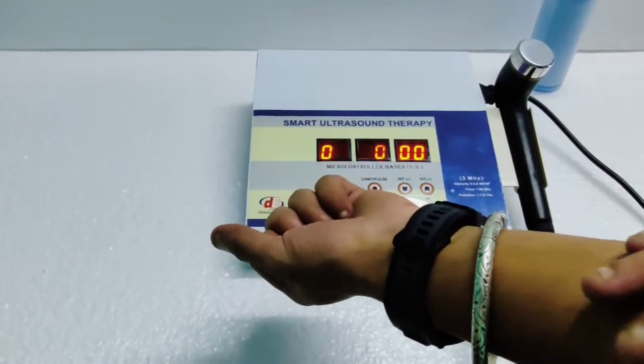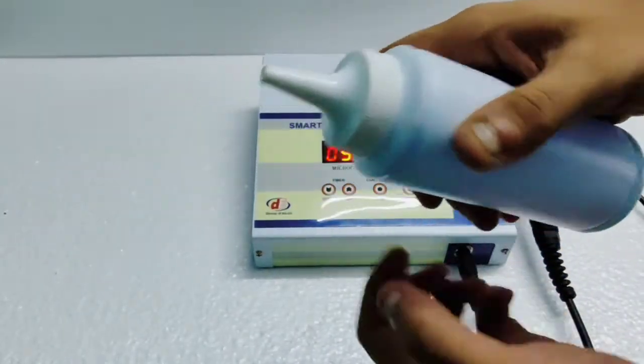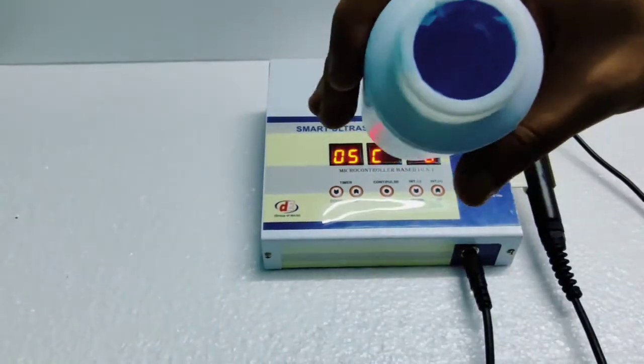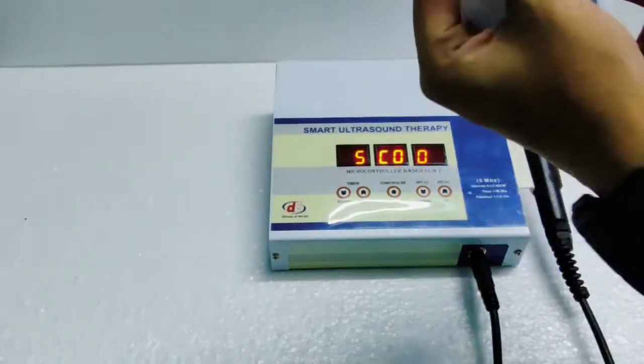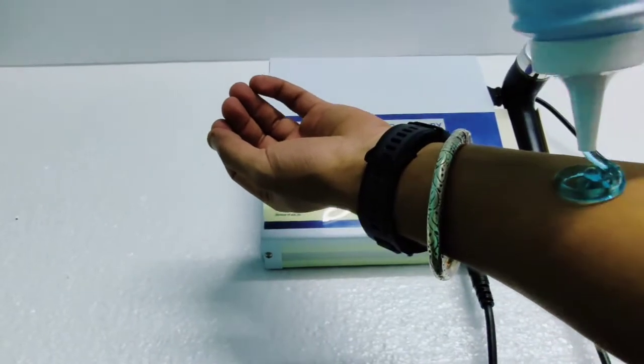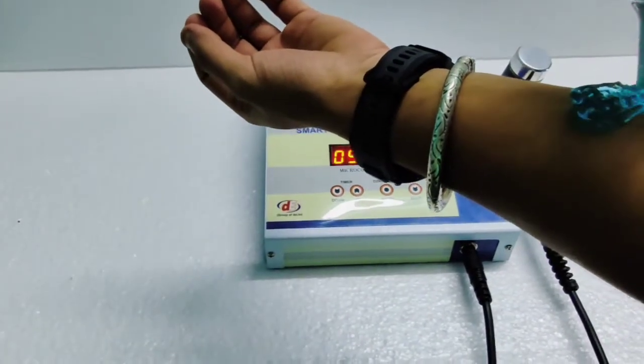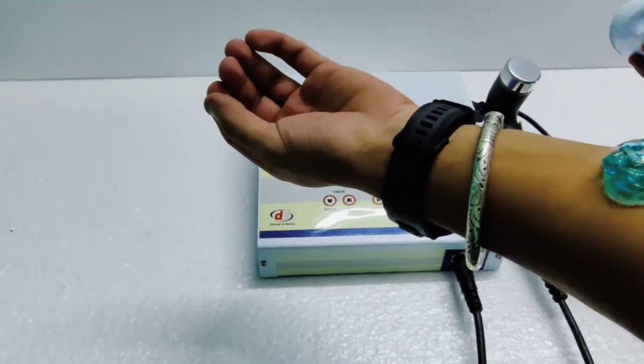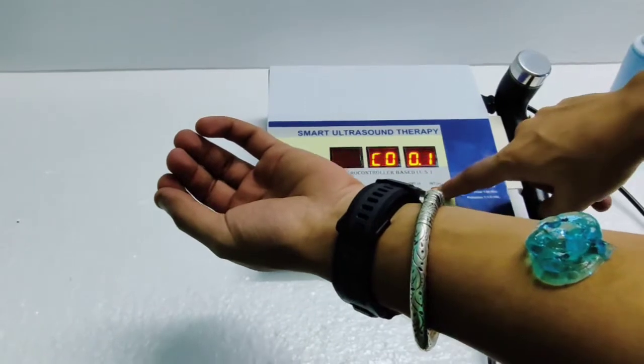First, take out some ultrasound gel. You can use any ultrasound gel to do therapy. Put some ultrasound gel like this, and now increase the intensity.